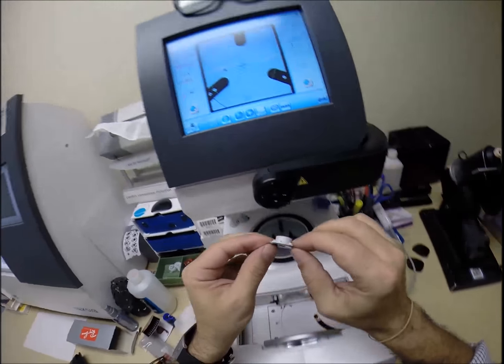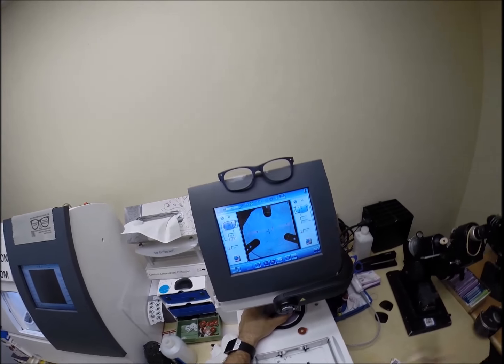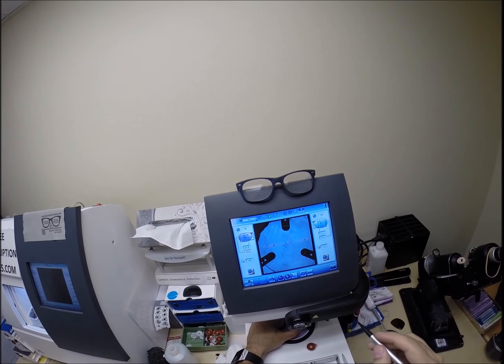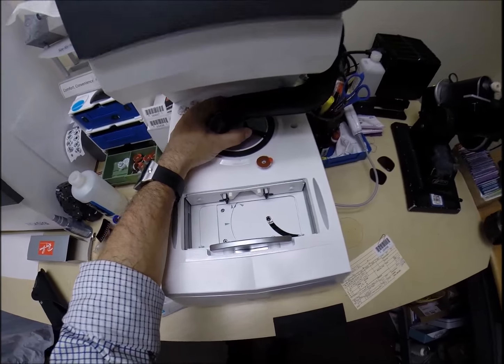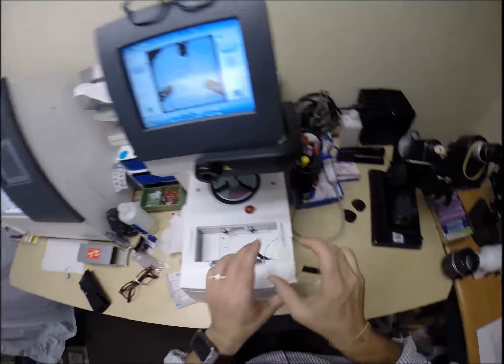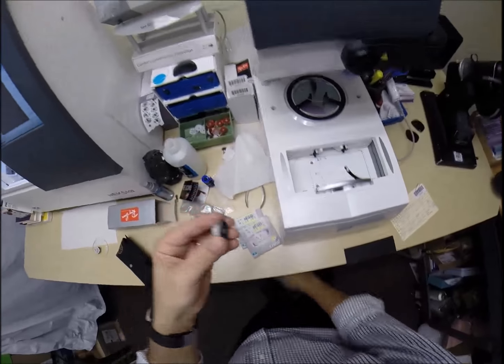The first time it's going to attach itself to another magnet right there. Get everything lined up the way it's supposed to be. Those 3 dots are lined up. Check to make sure the lens is large enough, and it is. Hit that button, the arm's going to come down and place the block onto the right lens. Now we're going to do the same thing for the left lens.